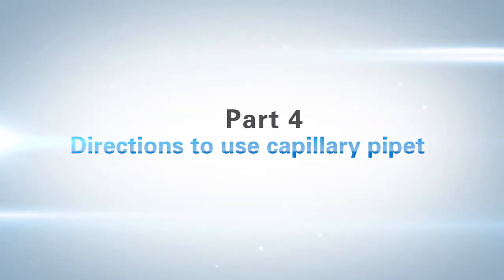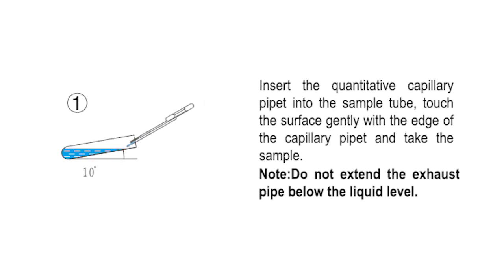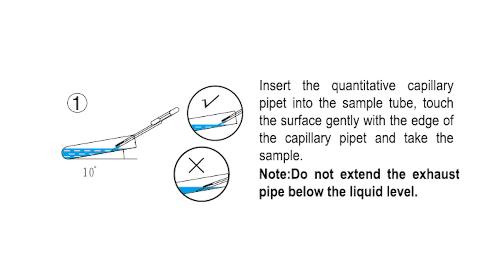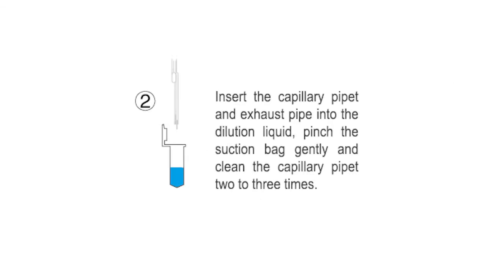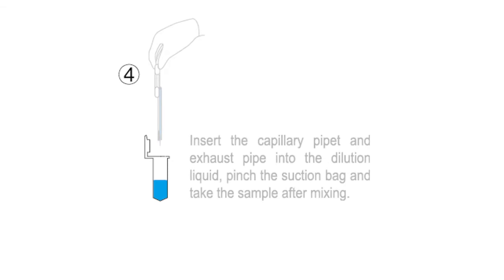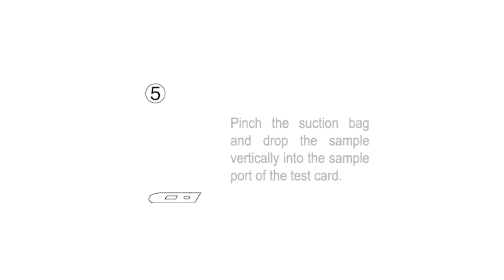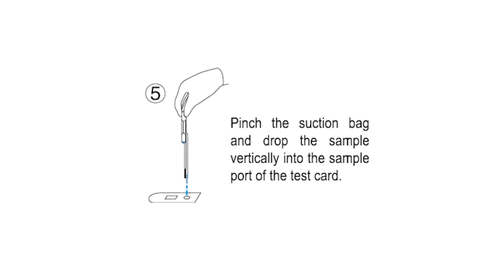Part 4: Directions to use the capillary pipette. Insert the quantitative capillary pipette into the sample tube and touch the surface gently with the edge of the capillary pipette to take the sample. Do not extend the exhaust pipe below the liquid level. Insert the capillary pipette and exhaust pipe into the dilution liquid and pinch the suction bag gently to clean the capillary pipette two to three times. Mix the dilution manually, then re-insert and pinch the suction bag to take the sample after mixing. Pinch the suction bag and drop the sample vertically into the sample port of the test card.